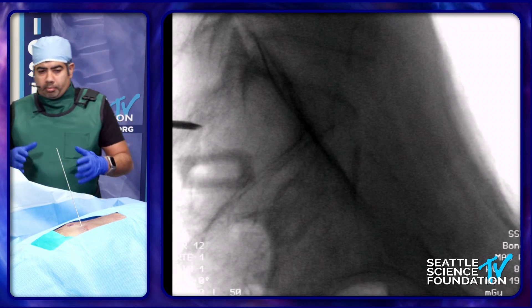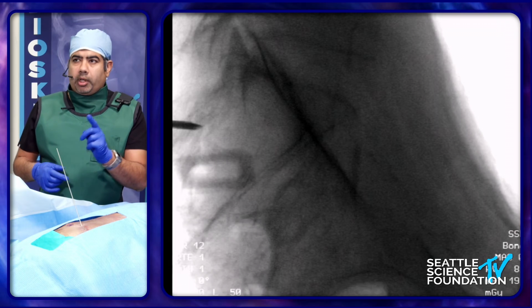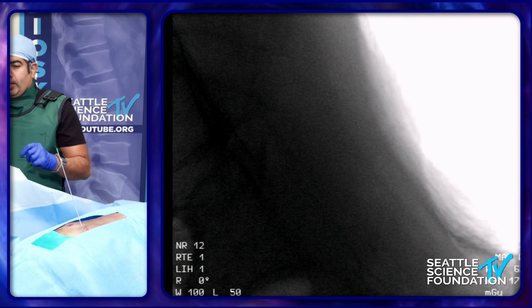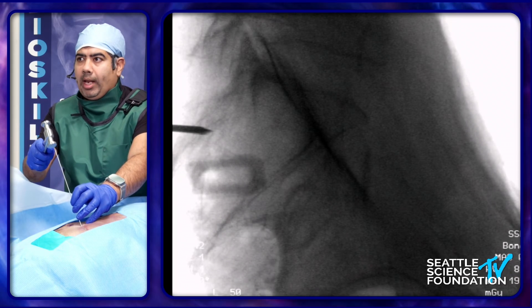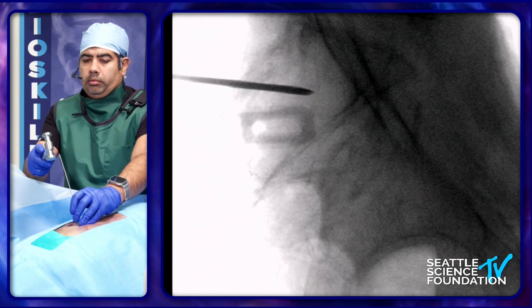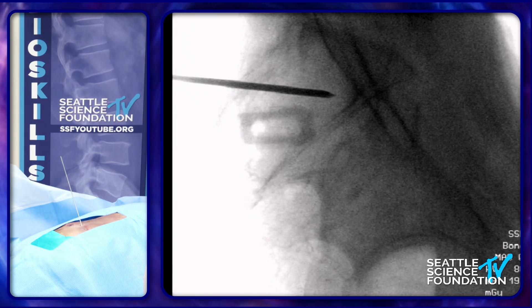There are some logistic issues here over the table, but you can see that Steinman pin coming in — so we know we have the correct trajectory getting into the SI joint line. I'm going to confirm I'm in the right spot and then mallet the pin in gently. Once I've done that, like Ramo showed, I am in the SI joint.